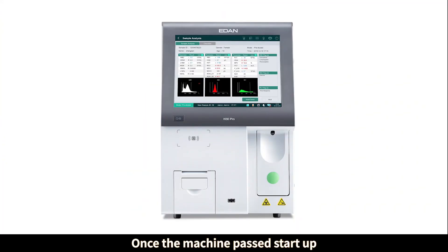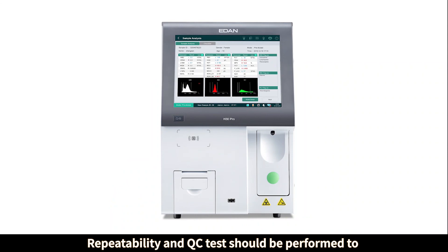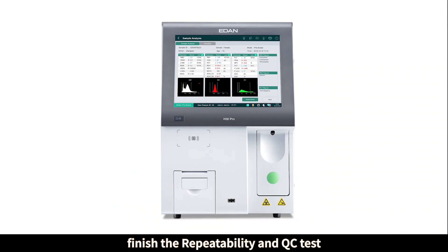Once the machine has passed startup, repeatability and quality control tests should be performed to confirm the analyzer's condition. Please refer to the H30 operation video guide to finish the repeatability and quality control tests.